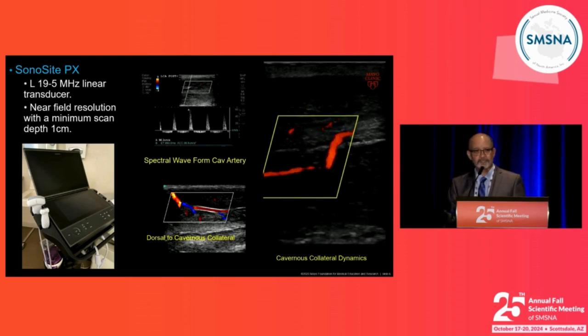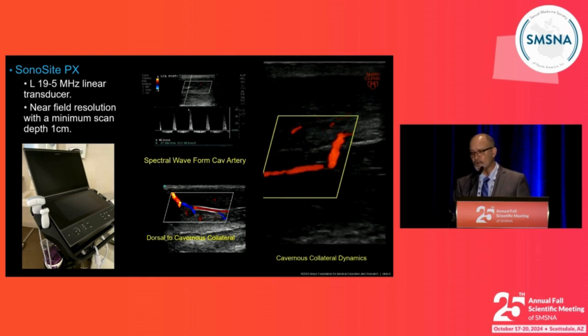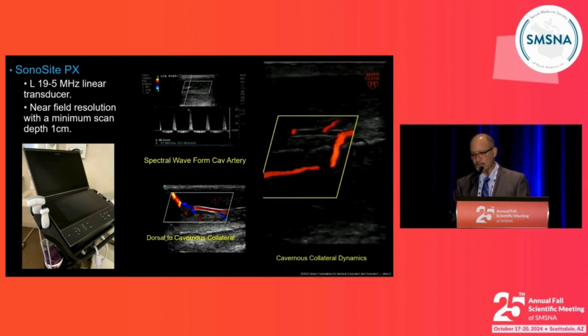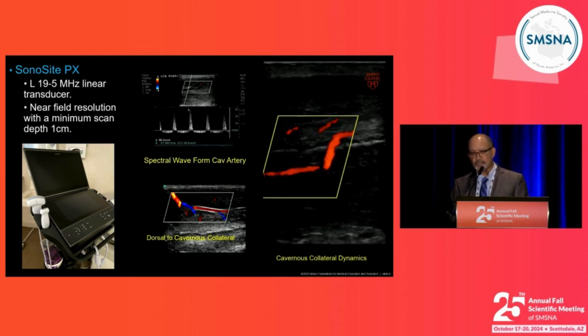Well, the duplex Doppler technology has gotten a lot more condensed and a lot less expensive than when I was a resident. When I was a resident, the machines were about twice the size of this podium and were over $100,000. That's a typical machine, a Sonosite machine that you can find outside of your ORs, used extensively by our anesthesia colleagues for vascular access.